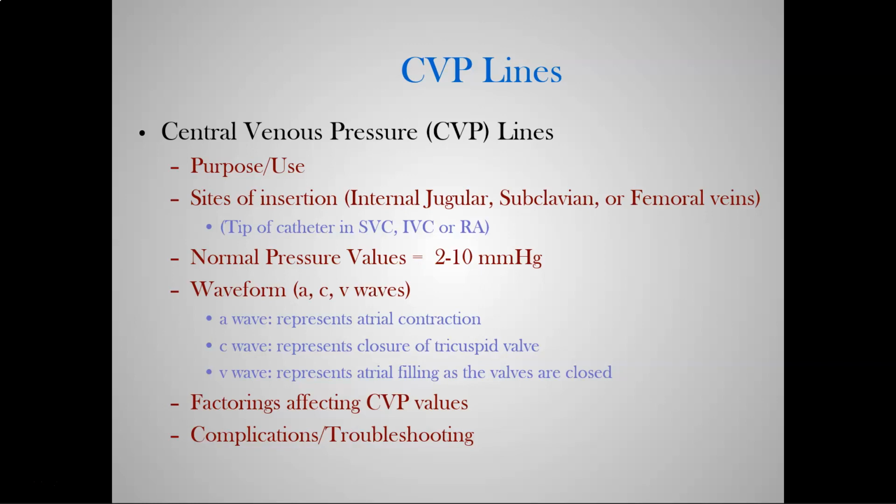So a lot of the times when we look at these CVPs and we're looking to see if patients have enough fluid volume, we're looking to see if there's enough preload, enough vascular support to get adequate pressure down to the renal arteries. And if there is not, this is a direct indicator of poor renal outcome and worsening condition. Remember, what's attached to the top of your kidneys?